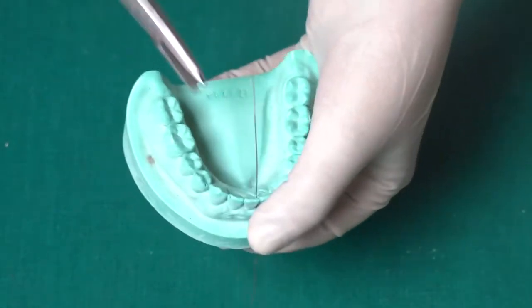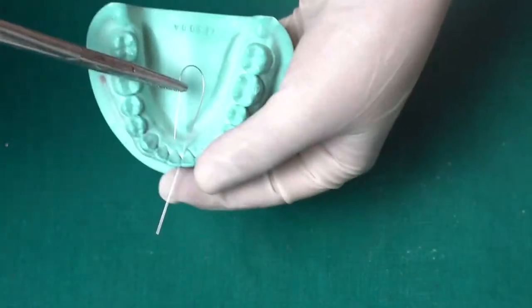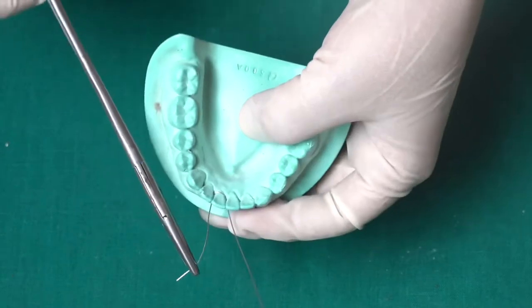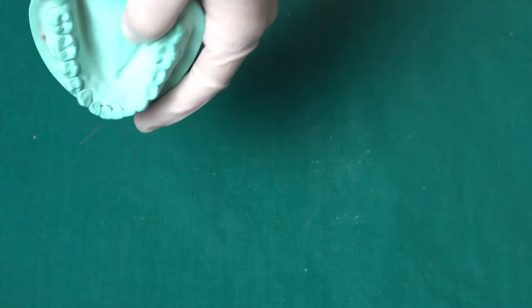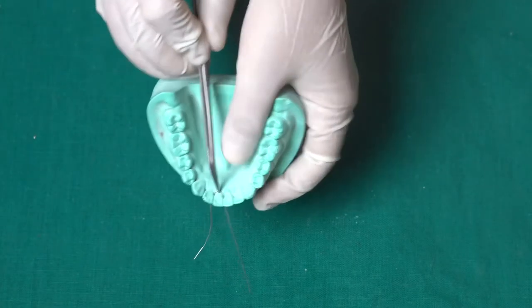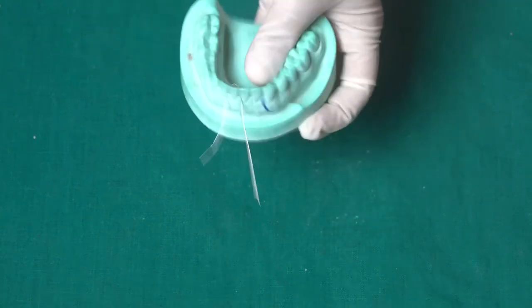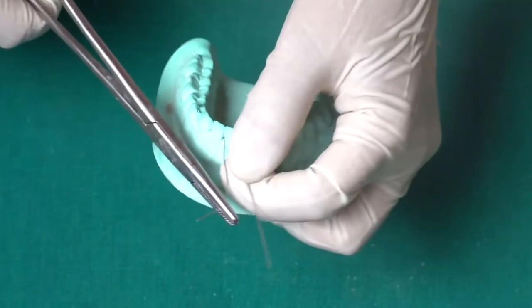Now pass a wire from the buccal to the lingual side. We have selected the central incisor, and again from the lingual to the buccal side in the distal region. On the lingual side where the wire has been passed, you can use a tweezer. The wire should be in the cervical region, not in the middle of the tooth — always remember this.